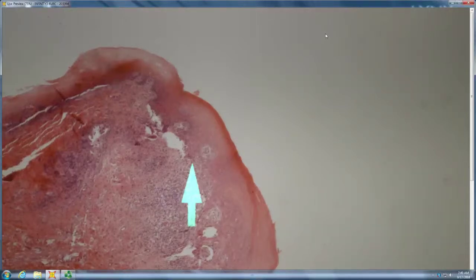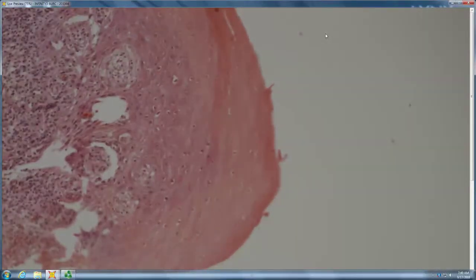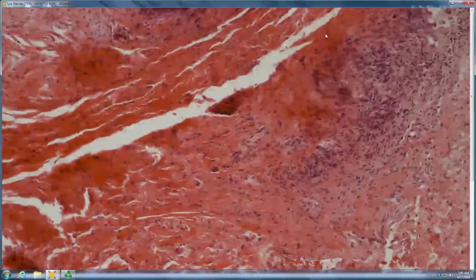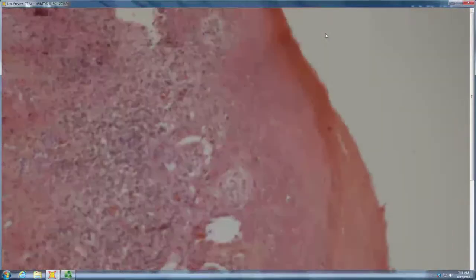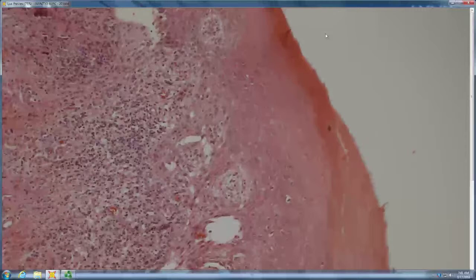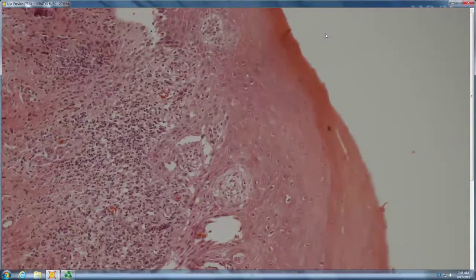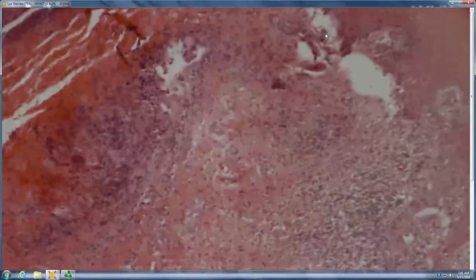Looks like, I can't tell, is this a mucosal surface? Yeah, possibly, probably not, because it really looks like there's bundled dermal collagen. Mucosa doesn't tend to have bundled dermal collagen, but I can't tell what those nests are down at the DEJ. So you may have nests or you may have pseudonests of inflammatory cells and dead keratinocytes. Tell me about your rete. They look kind of sawtoothed. What kind of sawtooth?